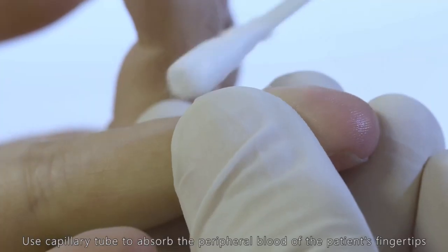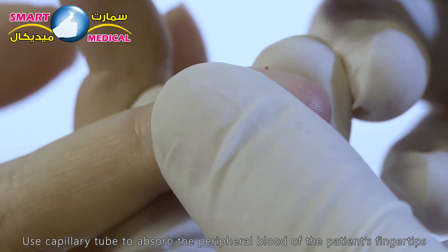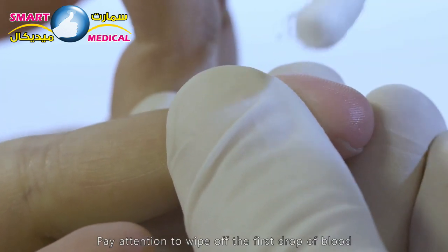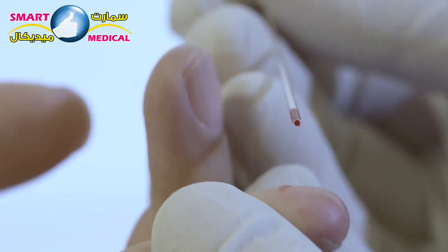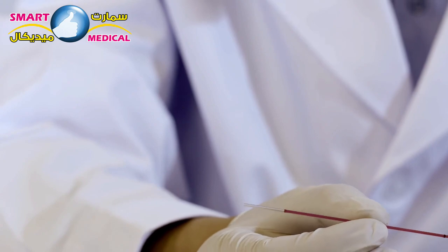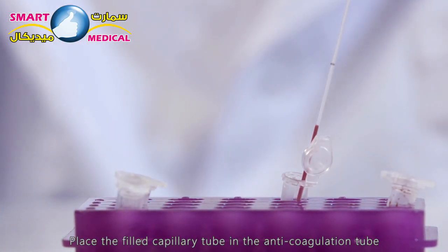Use a capillary tube to absorb the peripheral blood from the patient's fingertip. Pay attention to wipe off the first drop of blood. Place the filled capillary tube in the anticoagulation tube.